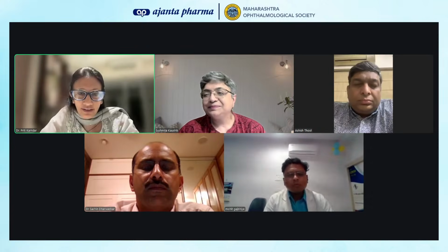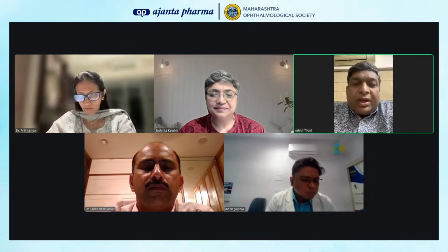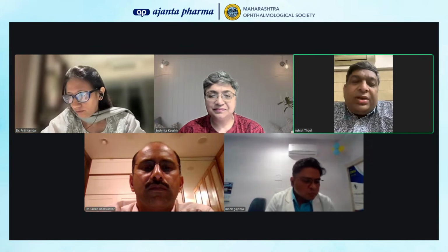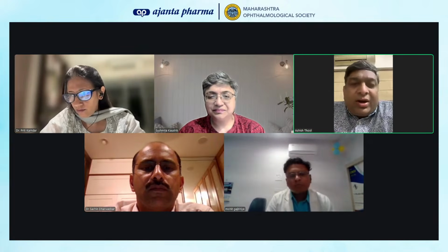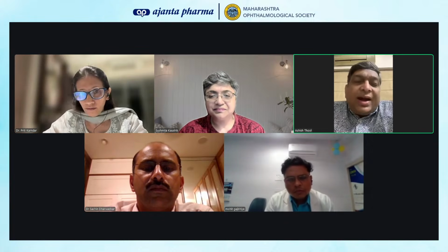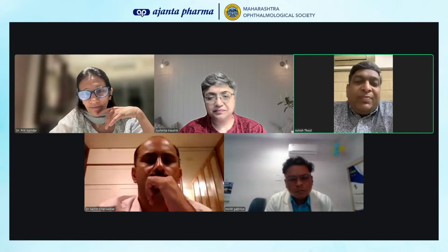Dr. Ashish. Yeah, I totally agree. It is not just that number thing that we are looking at. Theory in books will read that 5 micron change in average thickness, or 8 or 10 microns thickness in a quadrant change, or 12 microns change in a clock hour thickness. That is all right as just a guideline, but you have to actually look at what is actually happening to the patient, starting right from your slit lamp examination to giving attention to how well that image has been procured.